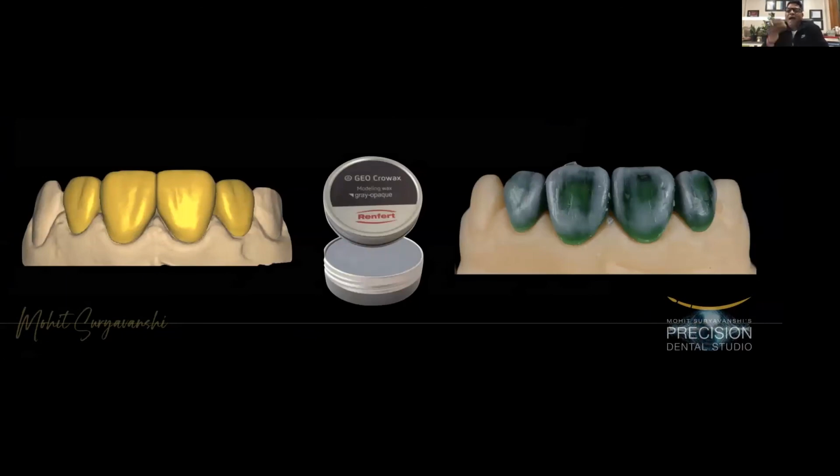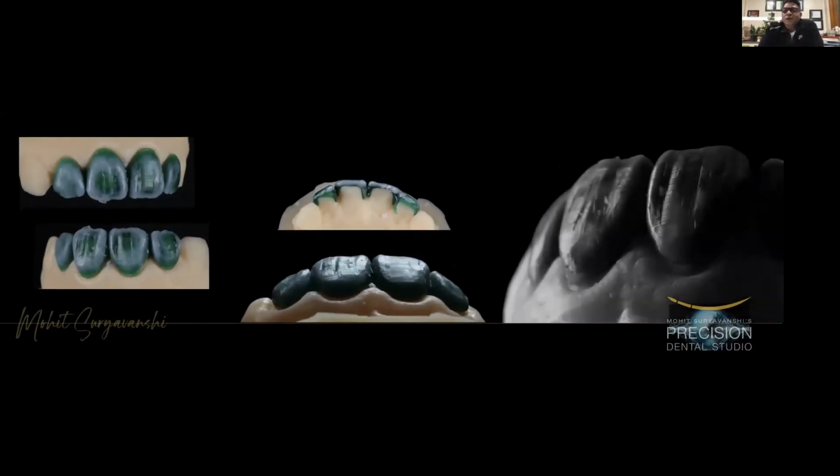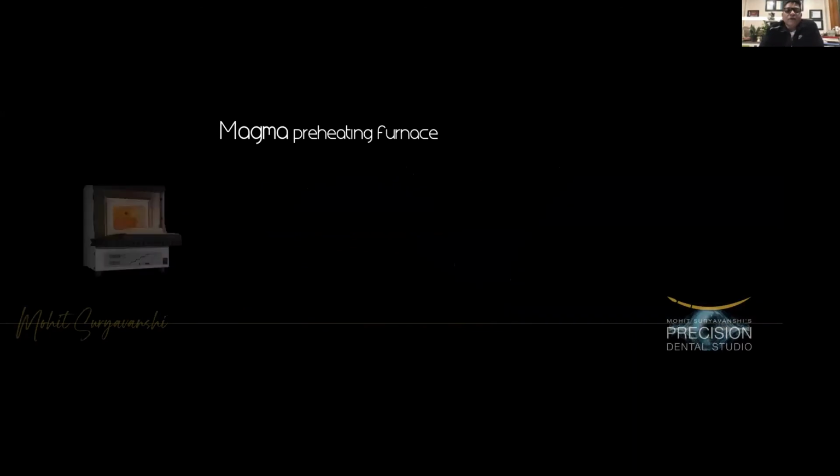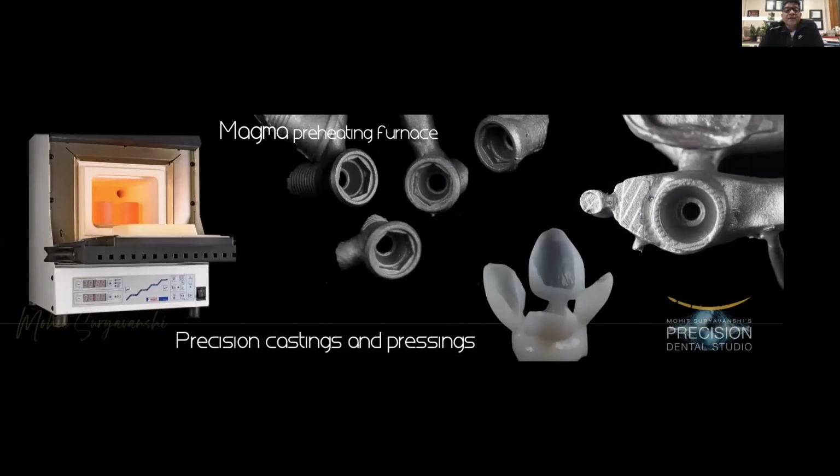But to add some life, it is very necessary to add some handwork to it. Only then do the restorations look really natural. You just cannot print them and then go ahead. So you have those restorations printed, and over that you nicely do some layering or add some character with the wax. So that's where I was telling you about this preheating furnace.